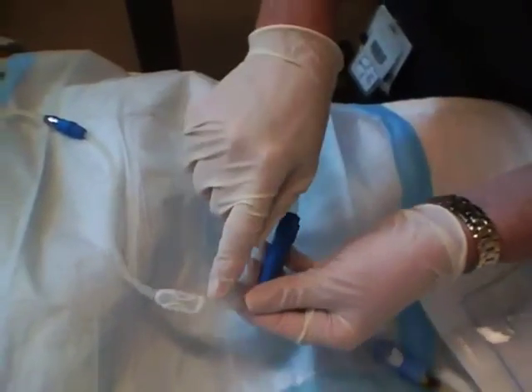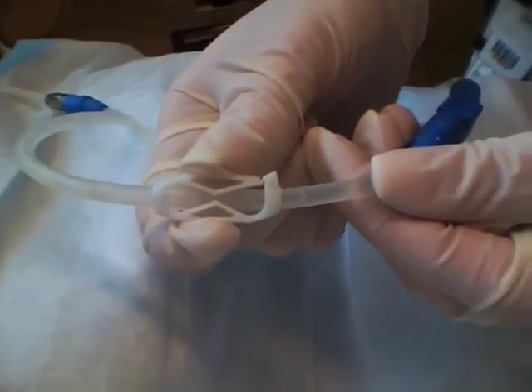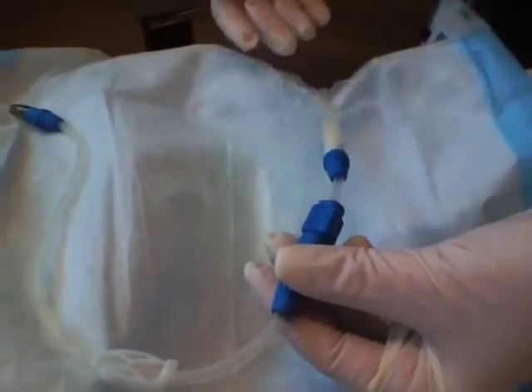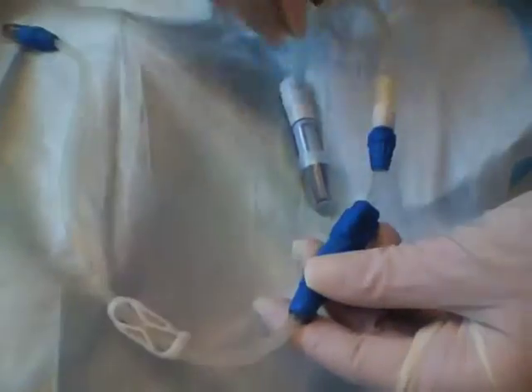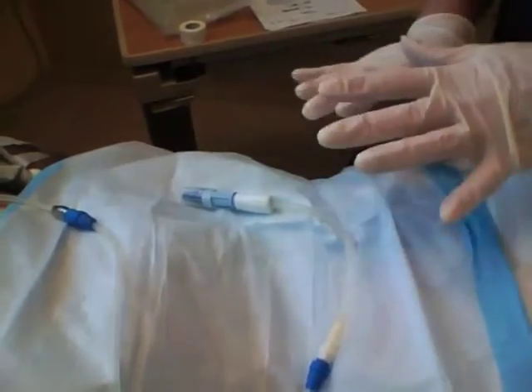Let's backtrack and make sure that your patient's clamp that is on their extension is clamped off, just because if that's open for some reason, when you make your connections here, you're going to end up with peritoneal fluid coming out. So just always make sure that this is clamped, which it is. Now we have this connection ready to go on our transfer set.